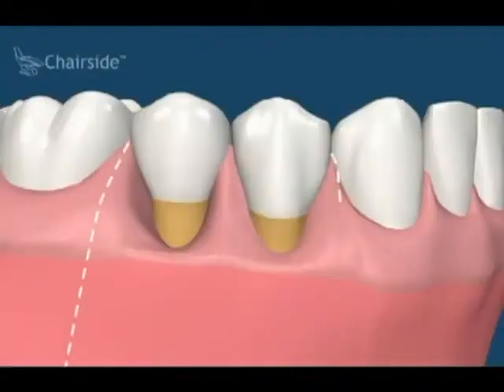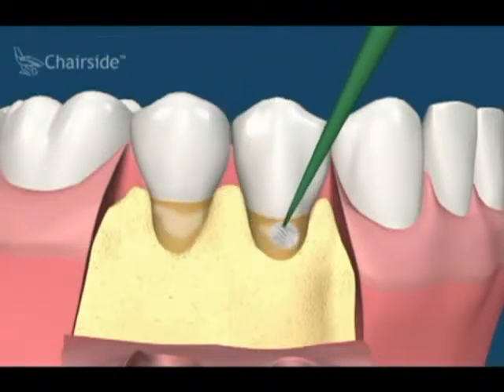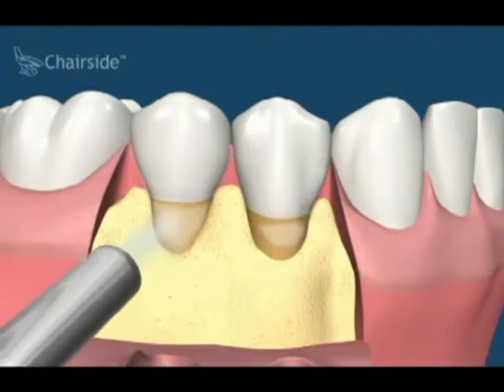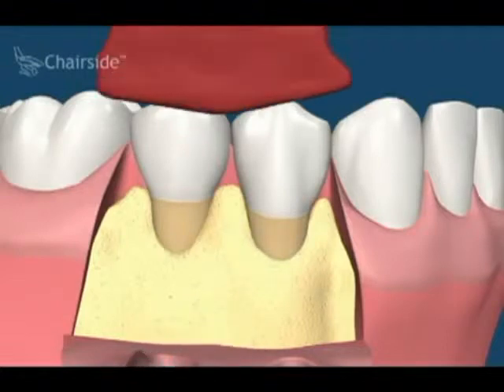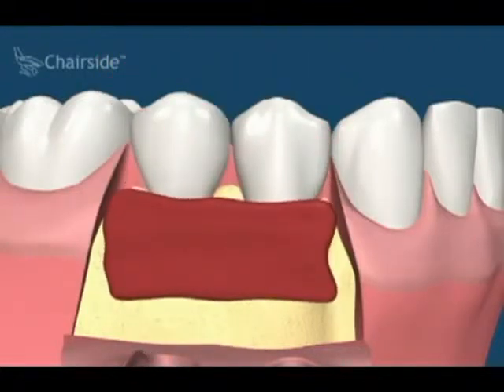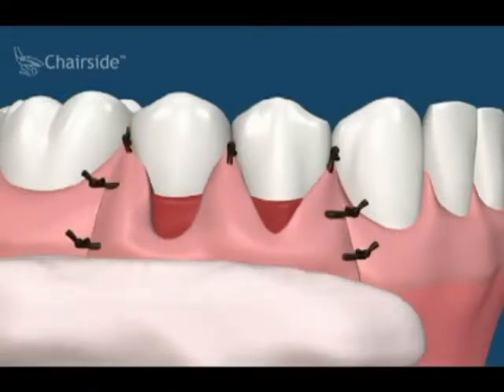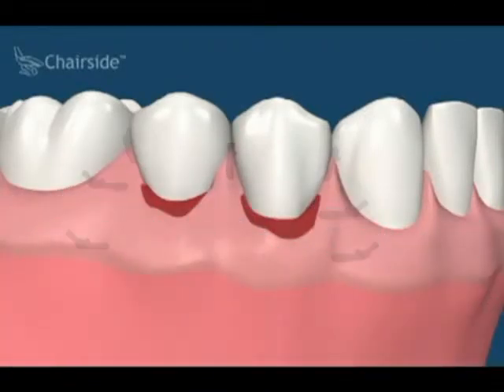This movie shows how we can perform root coverage and treat recession with insufficient attached gingiva in the area. The tooth roots are exposed and treated with different types of preparations, such as citric acid, to increase tissue attachment. A connective tissue graft is placed over the root areas. The gums are then moved higher up on the tooth and sutured into place, covering the root areas. A protective packing may then be placed. The attached gingival tissues heal and cover the area and roots.